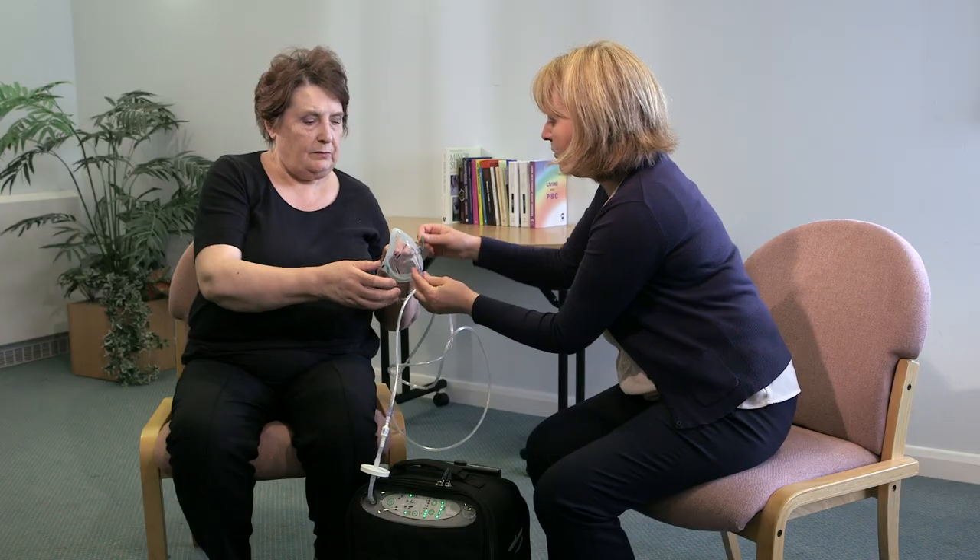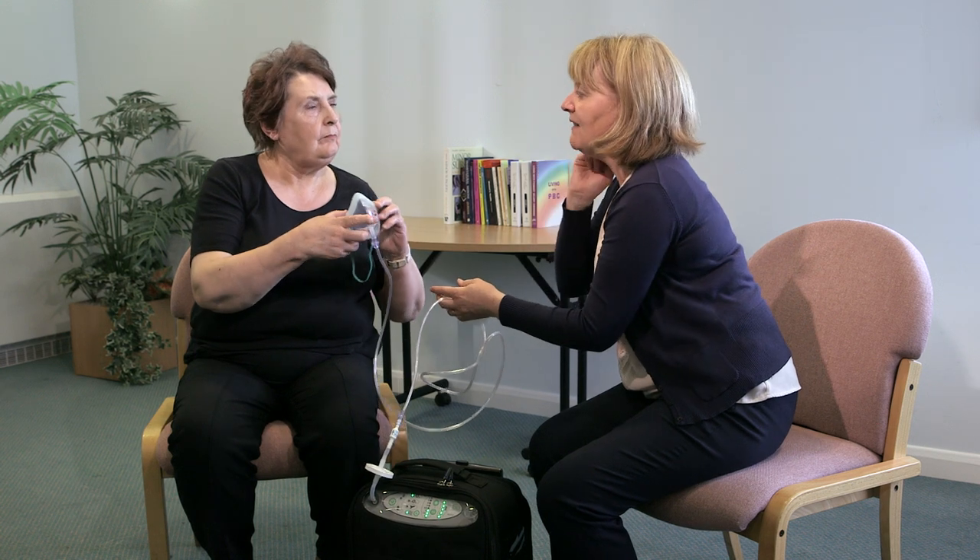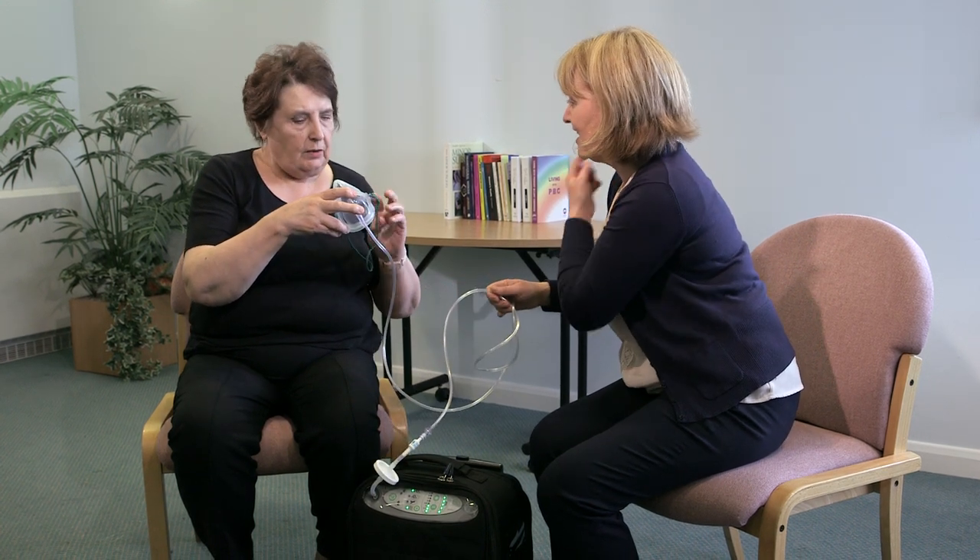Are you able to fit the face mask yourself? Yes? And are you sitting comfortable? Yes. Okay, now with that one, the elastic just sits under the ear — that's it. Have you got a good seal?